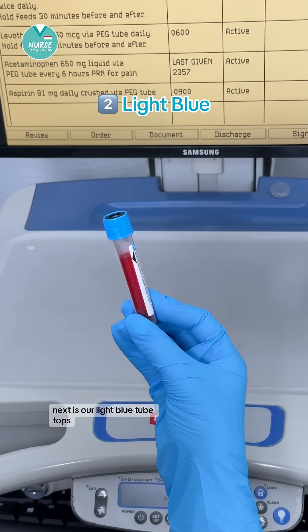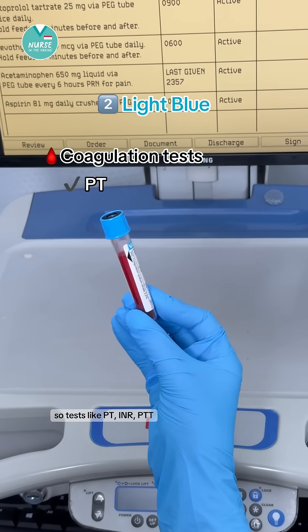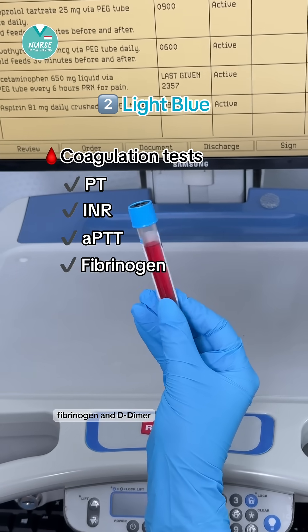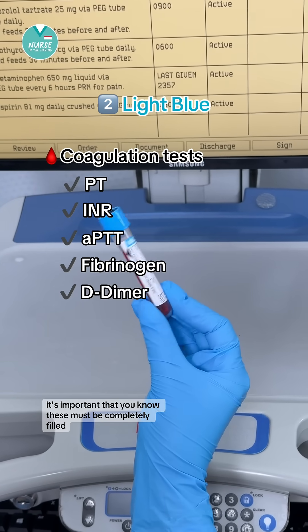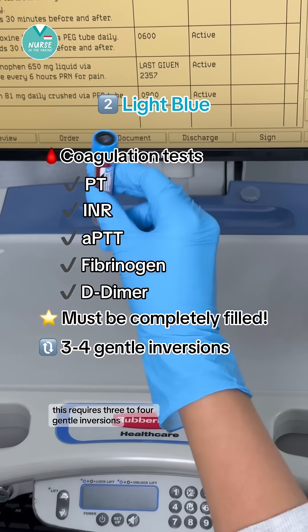Next is our light blue tube tops. This is used for coagulation tests — tests like PT, INR, PTT, fibrinogen, and D-dimer. It's important that you know these must be completely filled. This requires three to four gentle inversions.